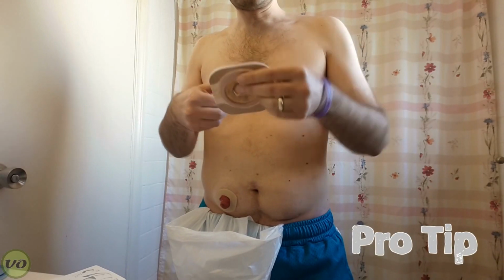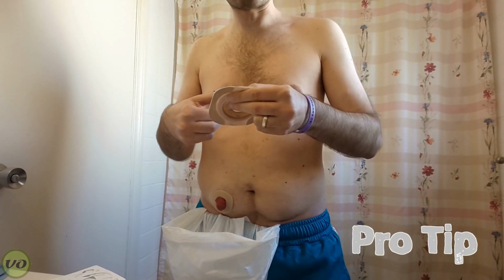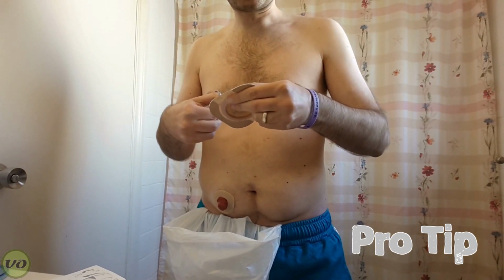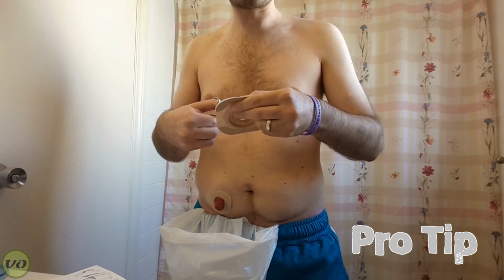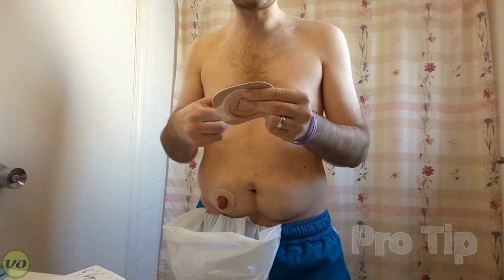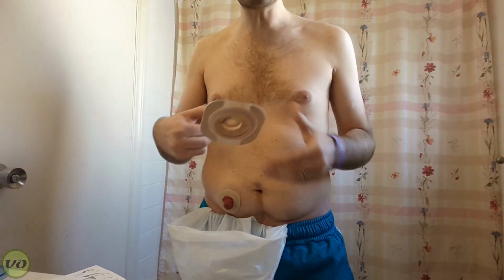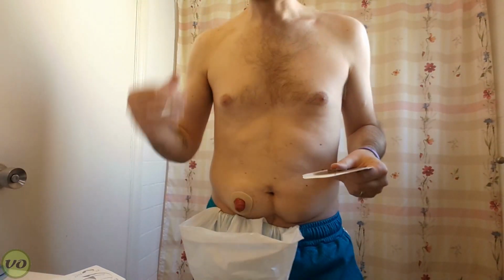Now when you're cutting these holes, you always want to make sure that you're not cutting it too wide. And you don't want to make it too tight around your stoma either, because that'll just lead to issues. Sometimes people get blockages when their appliance is on too tight. But you don't want to make it so loose that you leave a gap. Even if you're wearing a ring, you don't want a huge gap there, because it's just going to create more erosion either of your appliance or the ring itself.